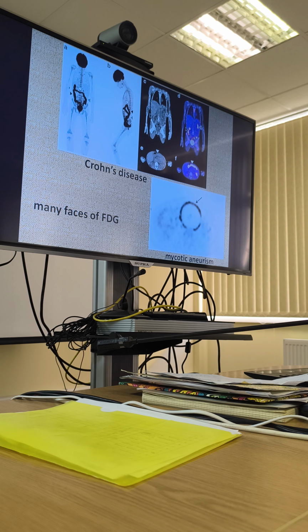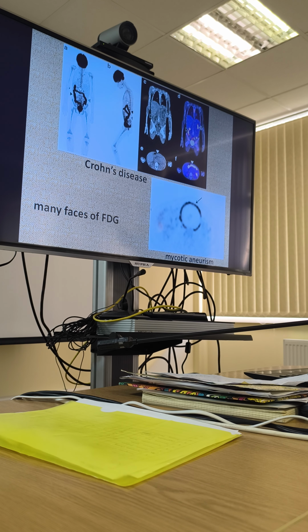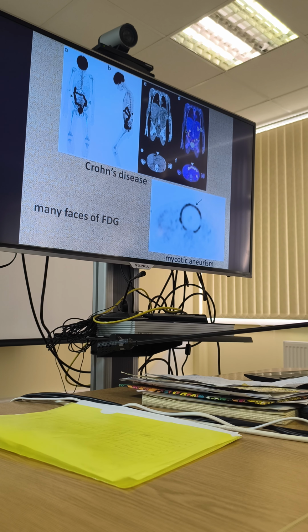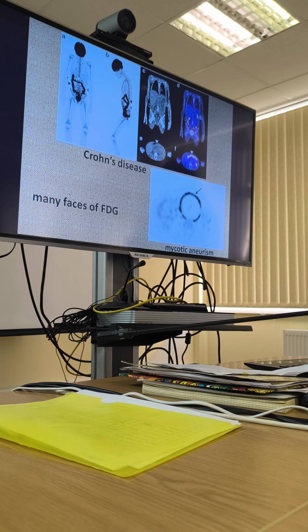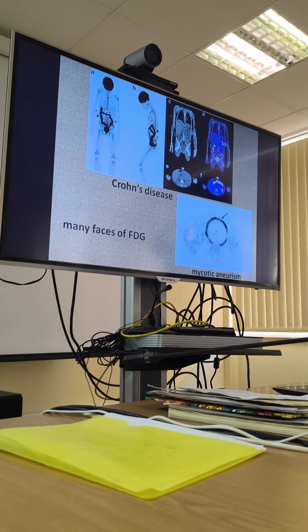We can look for specific inflammations. Let's say inflammation. What can be specific? The clinic can be specific, the spread can be specific, and the location could be specific. It's a really good idea to use it for looking for inflammations close, for example, to metallic medical implants.